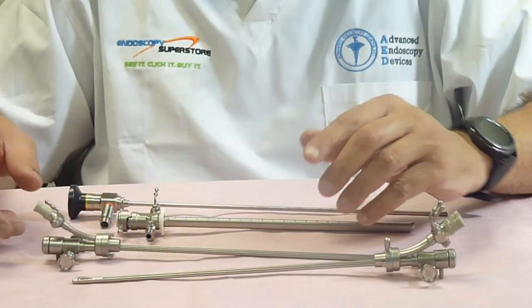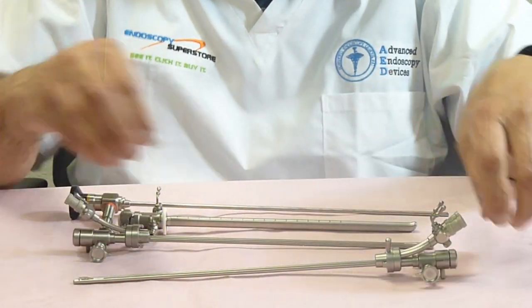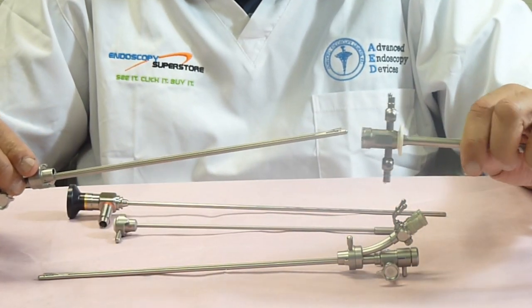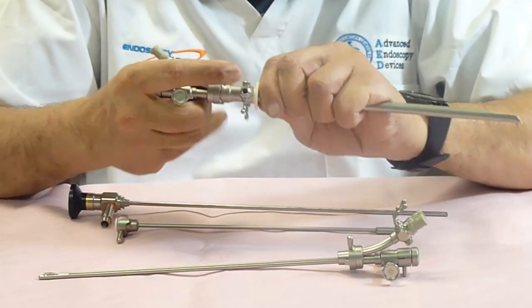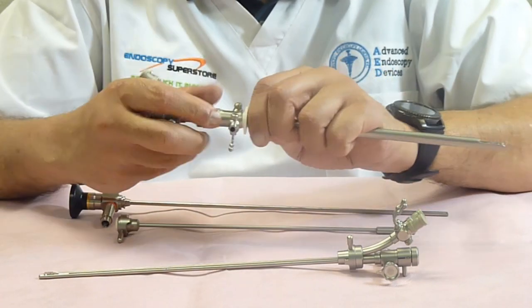At Endoscopy Superstore, we also have deflecting bridges. We have a single channel deflecting bridge and a double channel deflecting bridge. They adapt very easily to the sheath — it's got the same type of mount. In order to adapt it, it's just very easy: you go in there and lock it in, and now you have a channel through which you can pass an instrument.